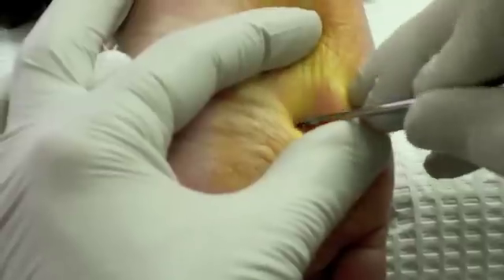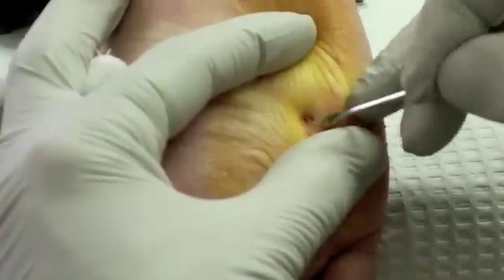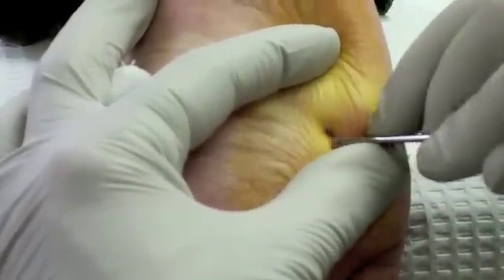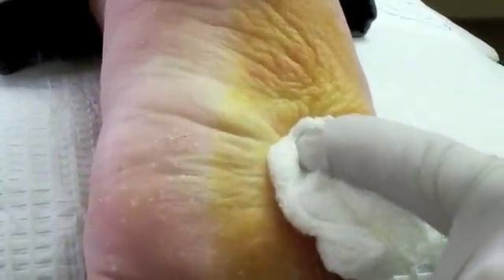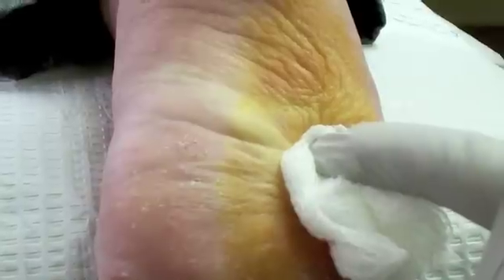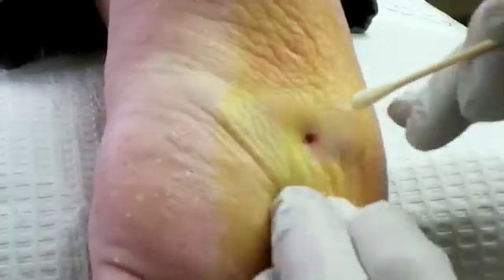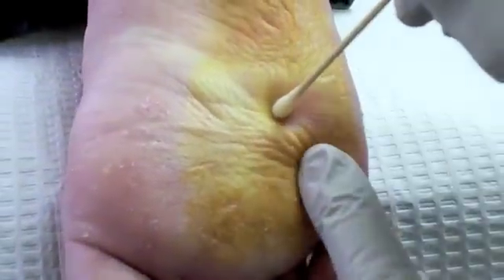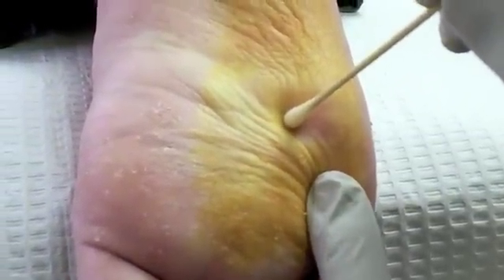I like to clean that whole area out — we don't want to leave any of that tissue behind. We'll put a little chemical medicine on it, a little bit of phenol to kill any remaining wart cells that might be there.